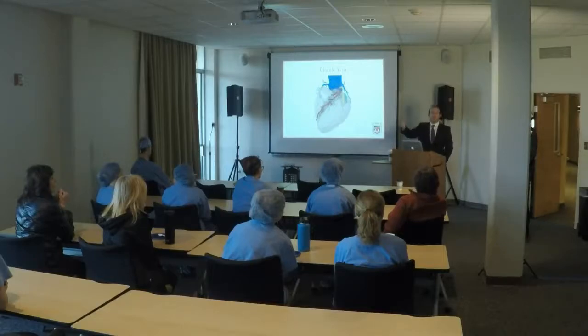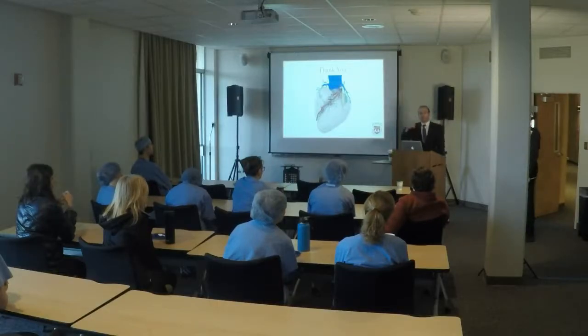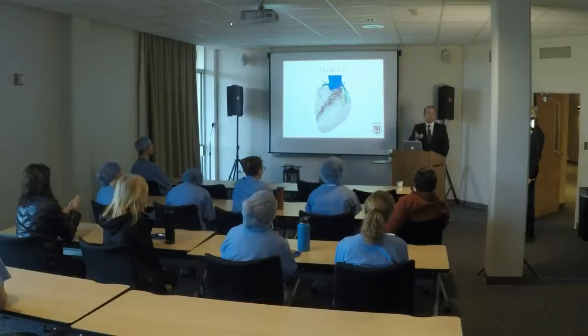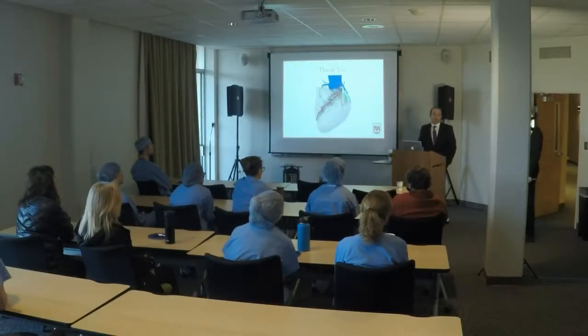So let's say the inpatient cardiologist has a patient that they want to order a CT on, we'll do it, but the majority are outpatient elective cases. And then there are ways where we can expedite the turnaround time if FFR CT is needed in the inpatient setting, and they usually have a turnaround time within an hour or two. So it's pretty fast.